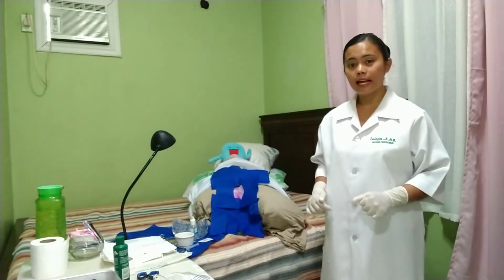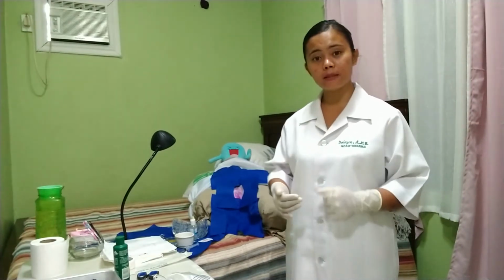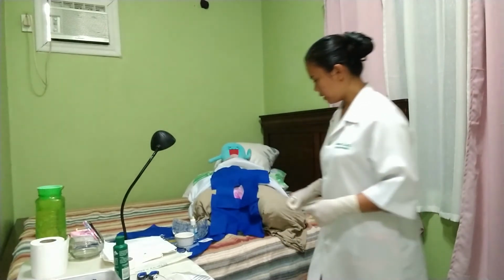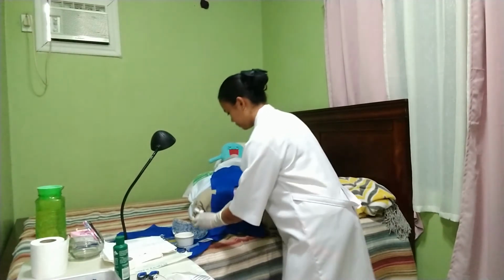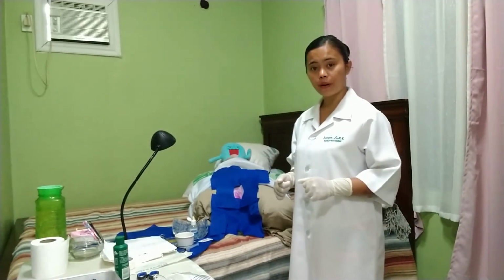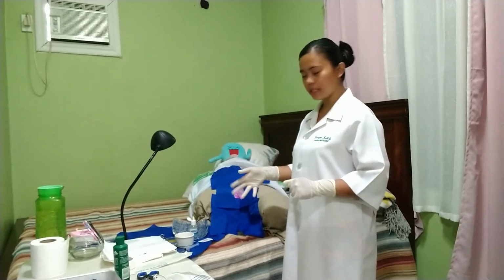Now remember that if a urine specimen is required, we have to remove the specimen container and uncap it. Place it near the patient for later collection, and let's do it. The next step to follow is to cleanse the urinary meatus of our patient. We have to use our forceps and our cotton ball with the betadine solution.